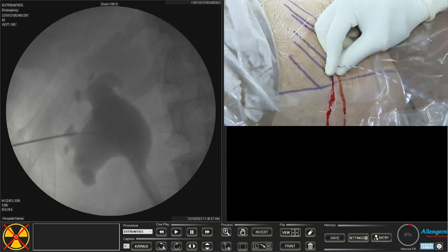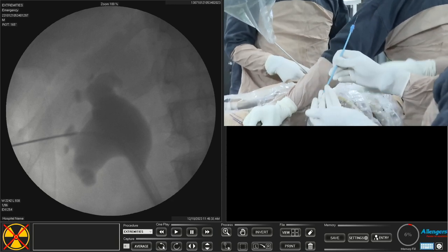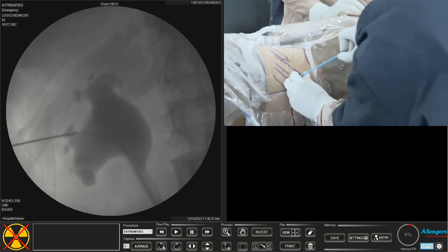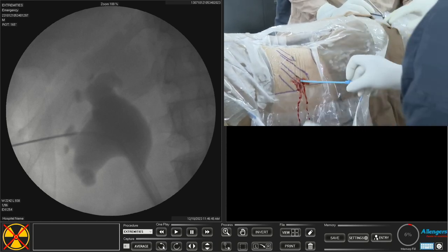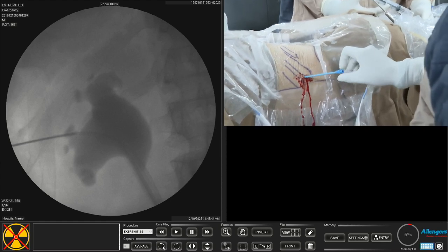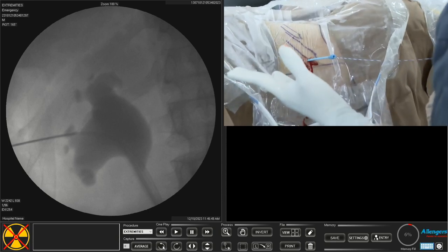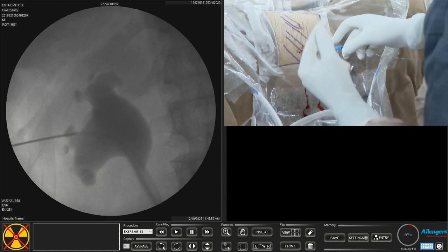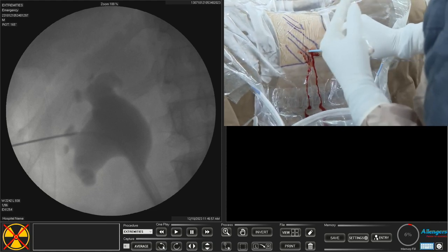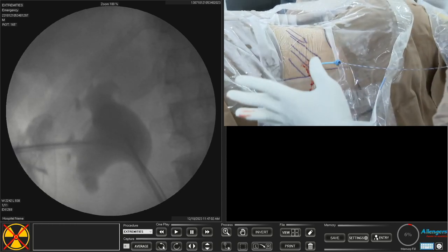I make a 5 mm nick incision, then introduce the fascial dilator and gently advance it. No force is needed — I maintain this angle at all times, dilating just up to the calyx. When the guidewire is in the ureter, you usually don't need to expose with fluoroscopy, and that is how you can avoid radiation.